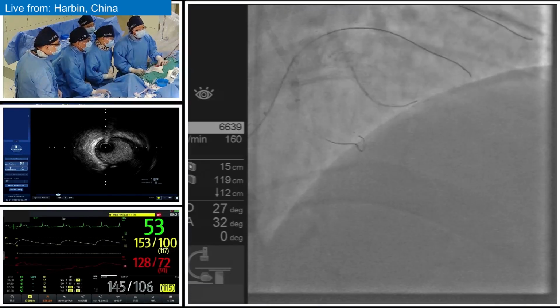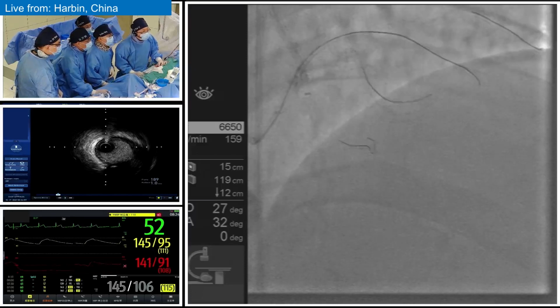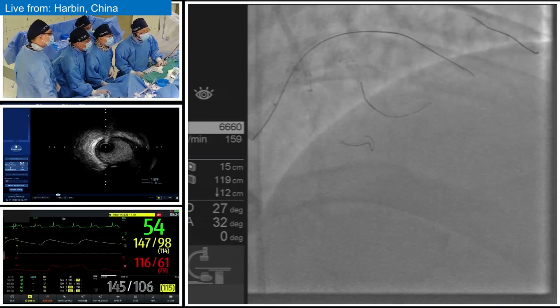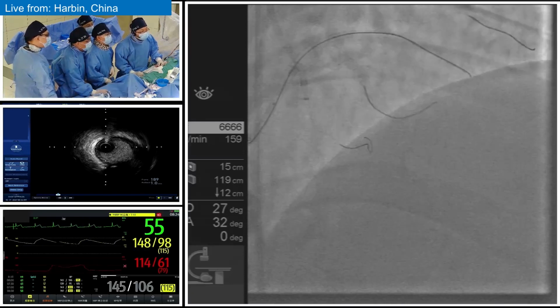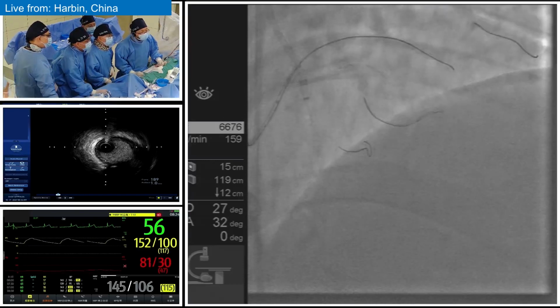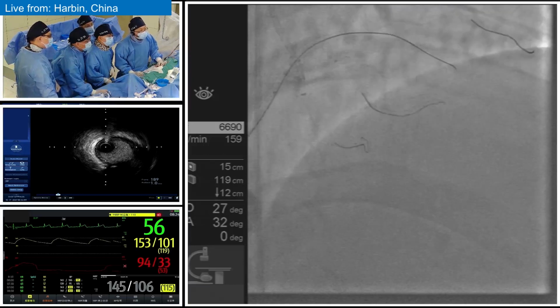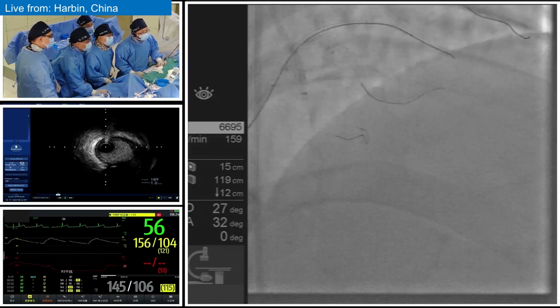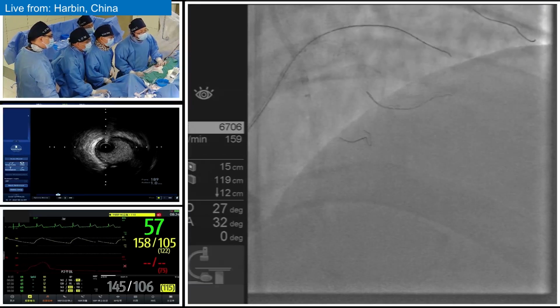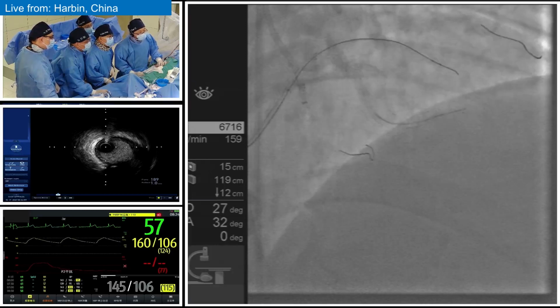Okay, Dr. Cao, you could go on. So we can see that Professor Li is working on the ADR technique. There are several issues that I think we need to clarify. For this case, although it's an LAD occluded segment, we may try our best to avoid all the important side branches. So that is number one, the information that supports us to perform the ADR technique.